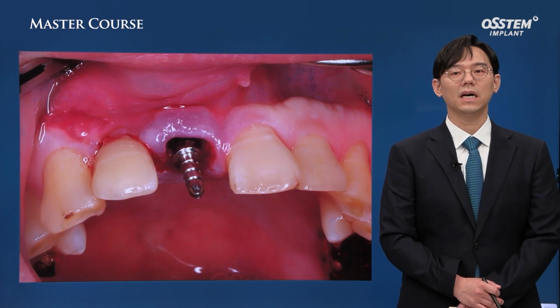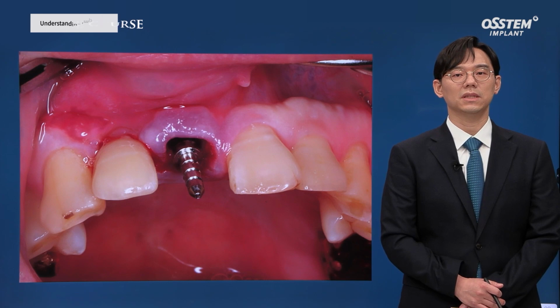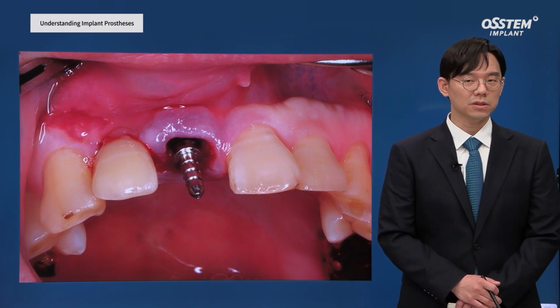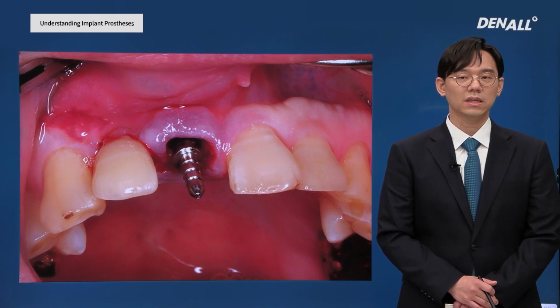In the panoramic image, you could not see a periapical lesion, so immediate implant placement was decided. Atraumatic extraction was performed. Initial prep is done. Guide pin is placed. In order to do a good job in prosthodontic treatment, you need to do surgery well, and to do this, you need to have a good understanding of prosthesis.